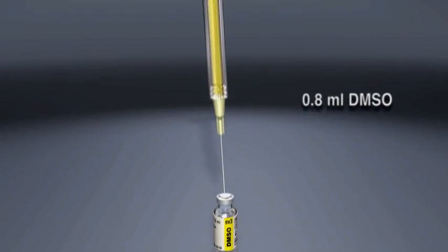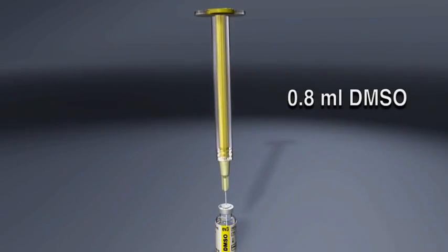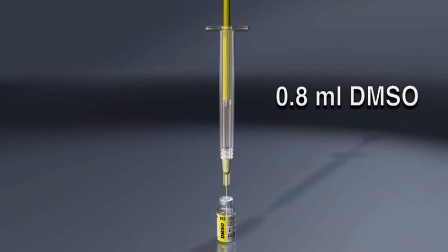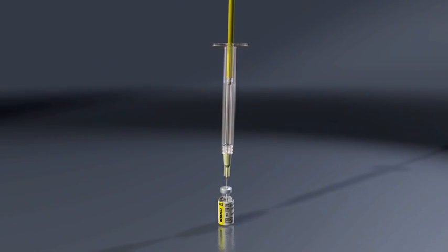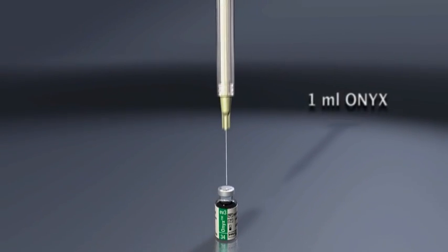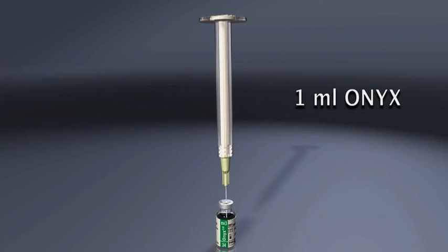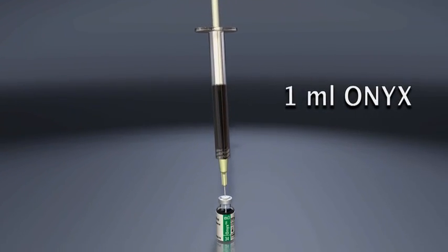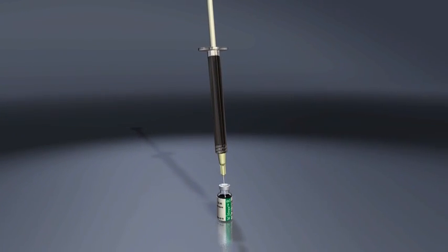Aspirate approximately 0.8 mL of the supplied DMSO into the yellow 1 mL DMSO syringe. Next, aspirate exactly 1 mL of the mixed Onyx into the white 1 mL Onyx syringe using an 18 or 20 gauge needle.